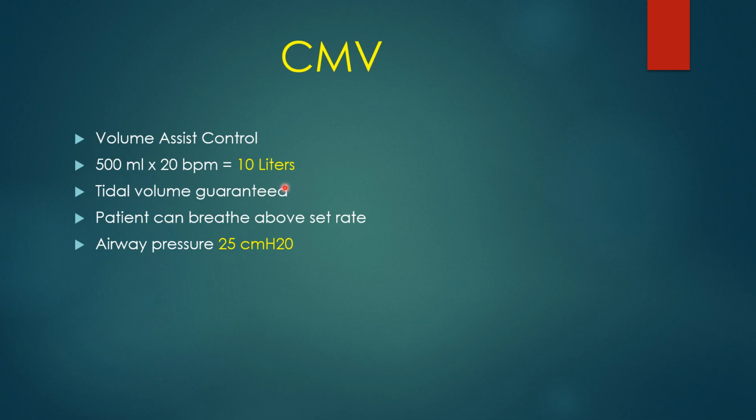Also, the patient may have developed some atelectasis, or the nurse may have a lot of fluid going in the patient. He becomes fluid overloaded. He may need to be suctioned. He could have bronchoconstriction, or lots of things that would make it more difficult for the ventilator to put in this 500 tidal volume. But the 500 tidal volume is guaranteed. What's not guaranteed is the pressure at the airway. So now we see here that the pressure was 20 to deliver that 500. Now it's 25.